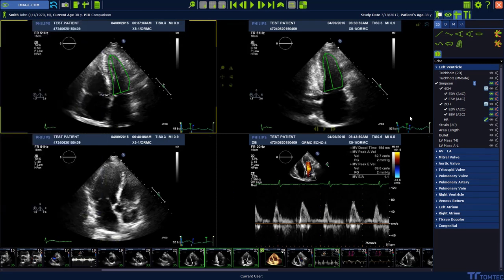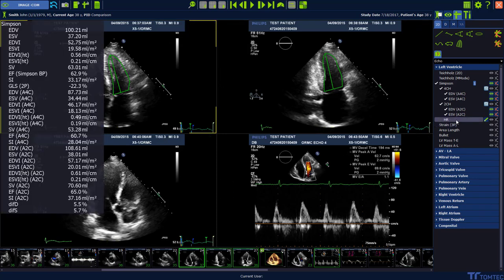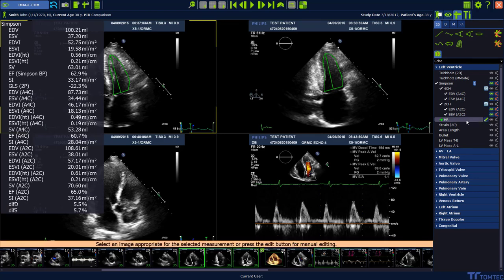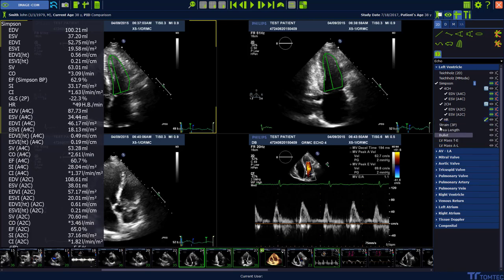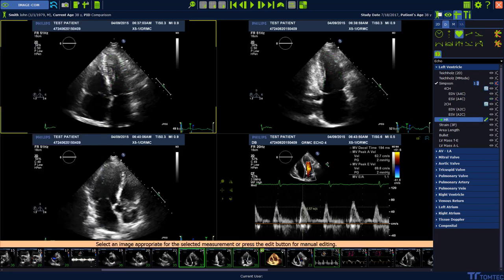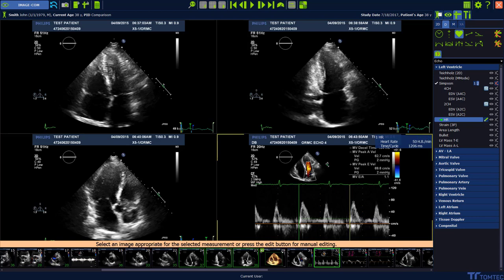The heart rate can be added to calculate the cardiac index — either manually by just adding the number, or you can also measure the heart rate in an M-mode or Doppler image. You just click in the image and then you can measure the heart rate.